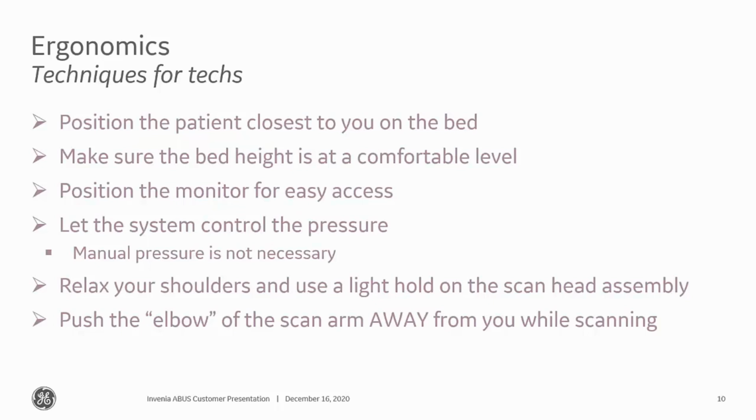I'm not one of those tall technologists, but sometimes if you are taller, that scan arm can get in the way, and especially when you're applying the pressure, it's weighted pressure, so the scan arm slightly moves with each pressure, so just be careful you're not hitting your head on that.